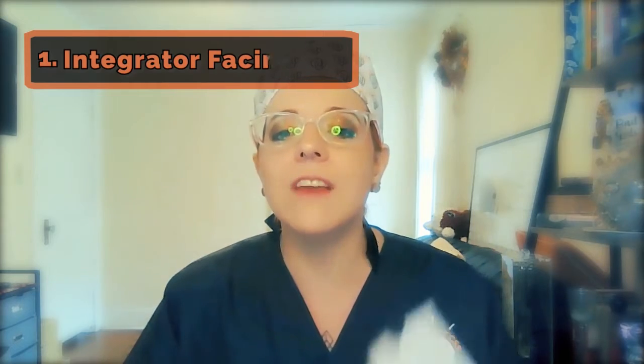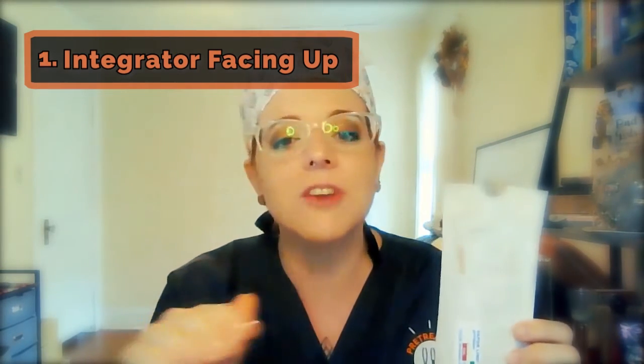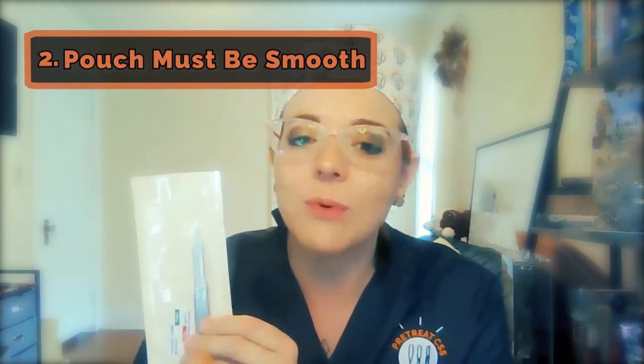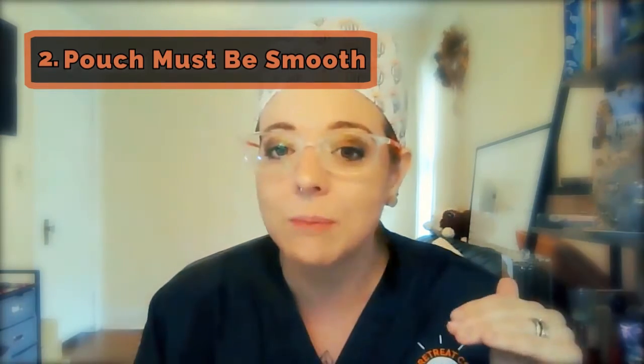A quick checklist. One: always have the integrator facing up inside the peel pouch — there's no exception. Two: when closed, the pouch must be smooth. That's right, folks — no folds, bubbles, or wrinkles are allowed to be present. It could totally compromise sterility.